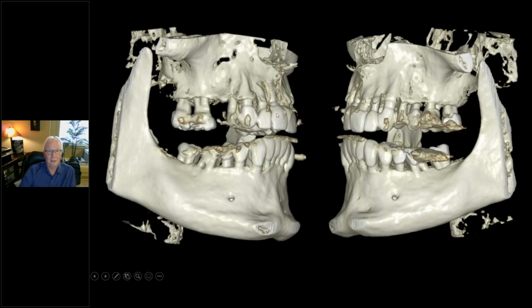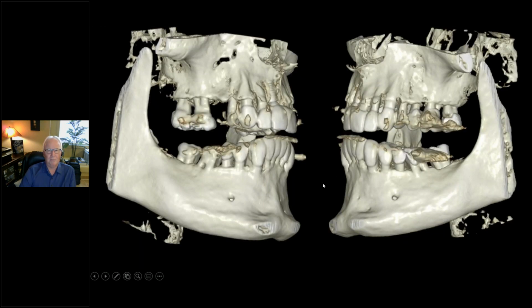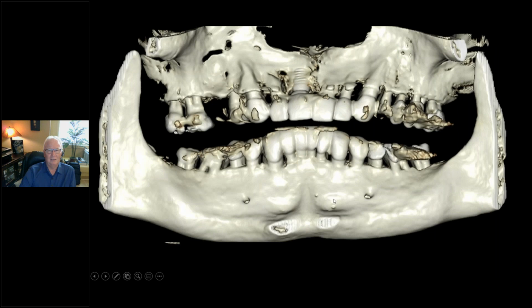Well, I guess he wanted it for aesthetic reasons, right? The implant doc, I'm missing a tooth up here, got knocked out. Well, okay, but why don't we think about getting the periodontium under control first, or at least advising the patient that maybe you're not a great candidate for implants until we have our periodontist consult, some disease under control before we do the implant. And you can't tell that from here. This looks great. Yeah, level looks good. Did a short implant, lots of bone. Sure, there isn't. All right.